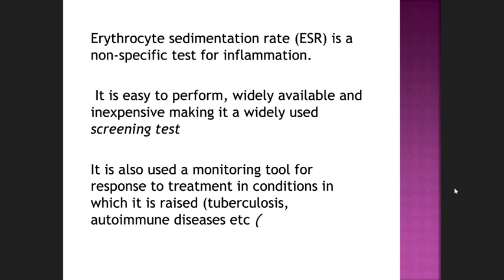No, Gaurav, not coagulation. Just be calm. See, first of all, who will answer this question? When we do ESR, which type of tube do we take? Sir, Westergren we take. No, the sample, when we draw the sample from the patient.